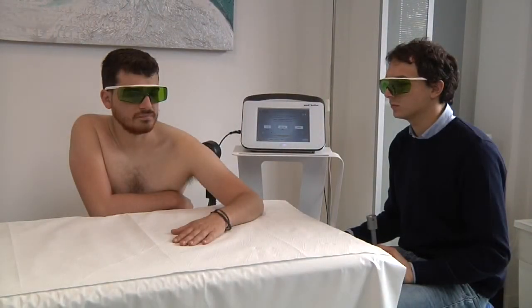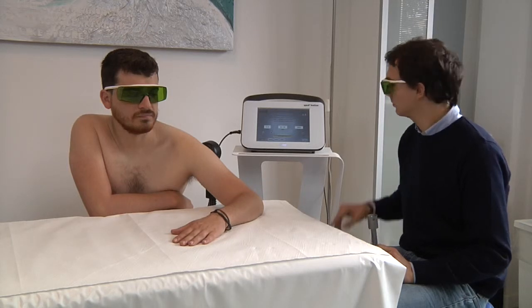For the second phase of treatment, we choose a biostimulating program in continuous mode. The treatment area will be limited to the insertional and pre-insertional areas of the tendons of the extensors of the carpus and of the fingers. The spacer is still the small one.